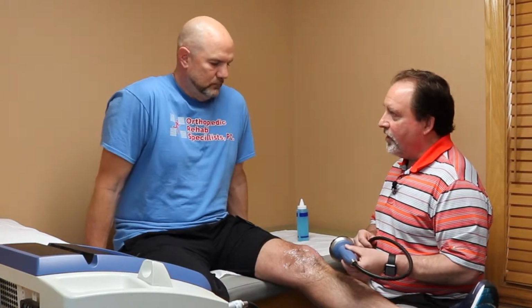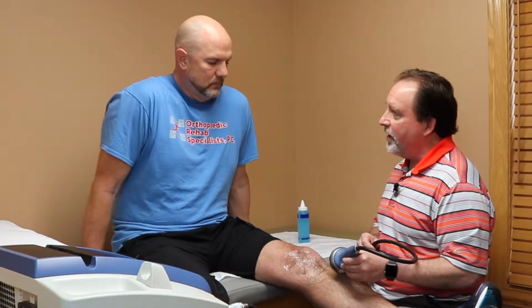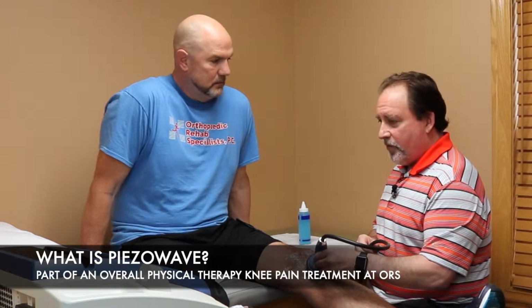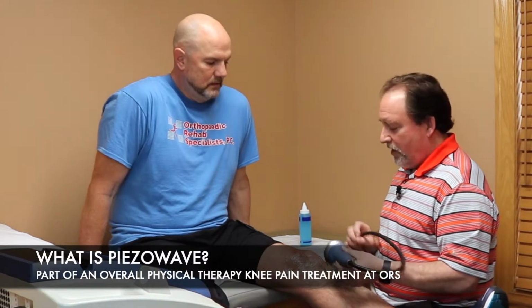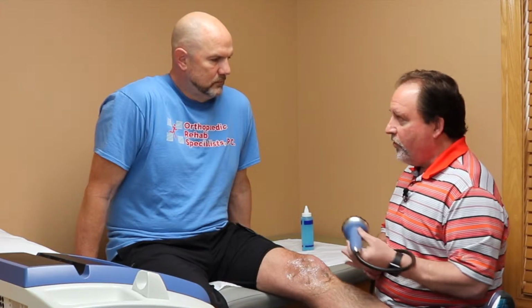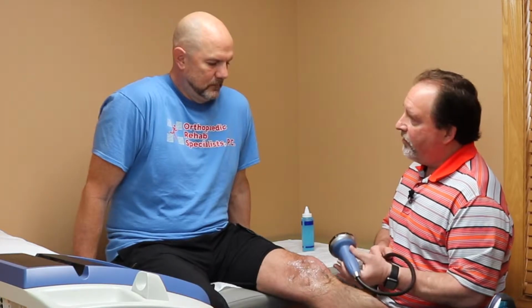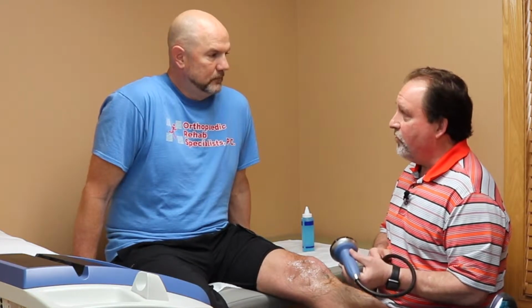So our communication is such that I'm going to start the machine, I'm going to move it, and when I find a spot, you're going to say, there it is. We treat that spot with 500 pulses, and then we find another one. Around the knee, we're going to find 3,000 to 4,000 pulses, maybe 10 to 15 minutes of treatment. We treat those spots, then move to another spot, communicating all the time. There is going to be a little discomfort, but it doesn't have to be a lot. You have to feel something.